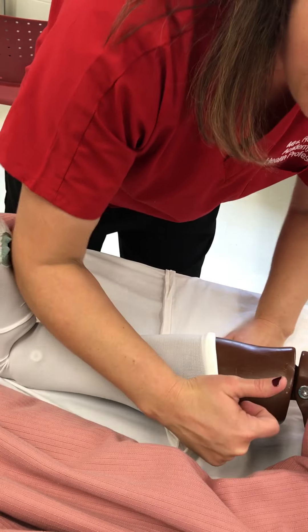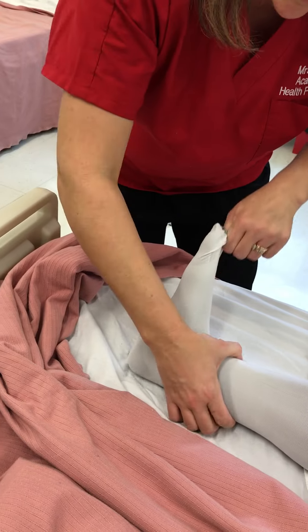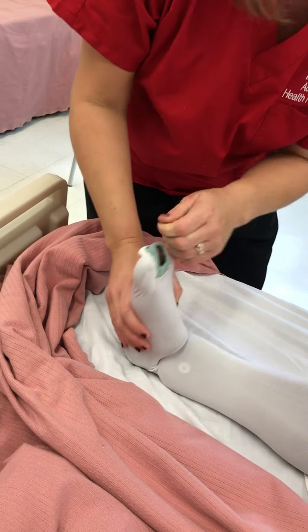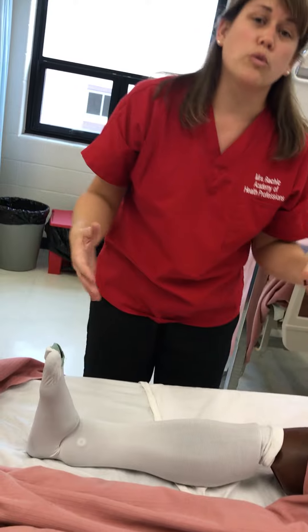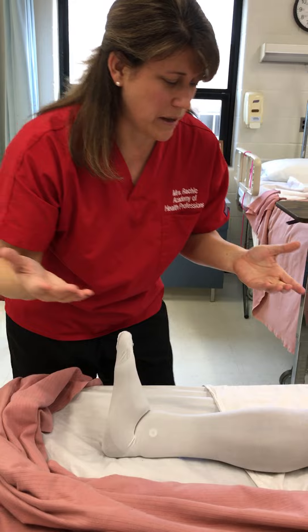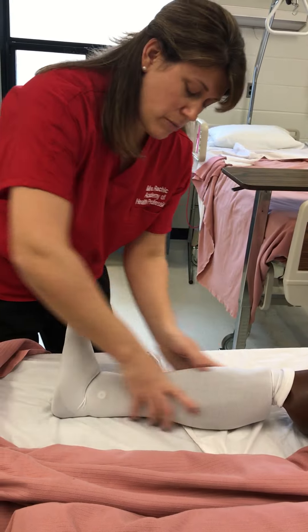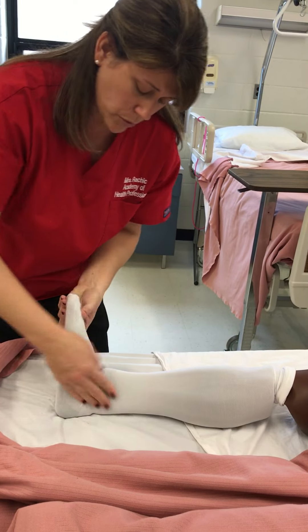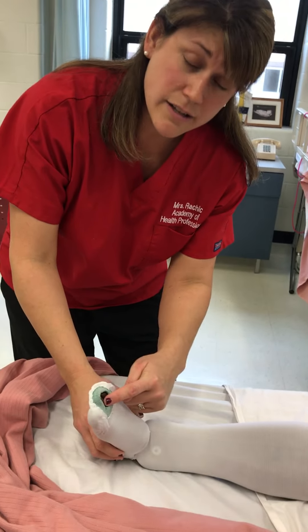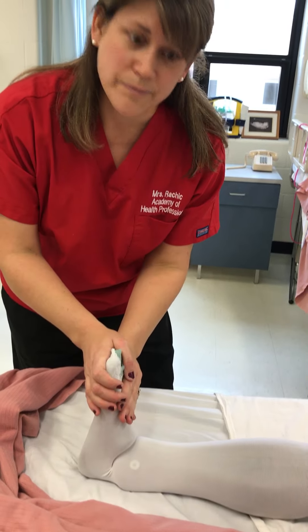On a human it's a little bit easier because they're not so wobbly. Now I'm going to go ahead and pull this up. And those magic words are: I see that there's no wrinkles or rolls. Obviously she has these joints and there's nothing I can do about that, but on a human being there should be no wrinkles or rolls. You need to finish with the toe in place — in this specific brand it's on top — and you need to finish with the heel in place.